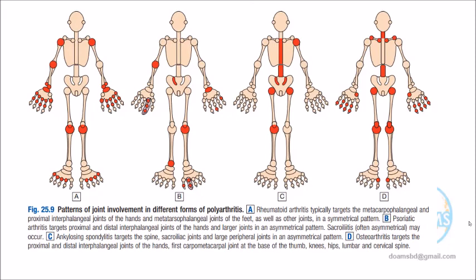But this is bilateral. Try to understand the words. Bilateral and symmetrical, these two words are not synonymous. Bilateral involvement, but not symmetrical. And hip joint, spine, and here you see age again, an important factor.